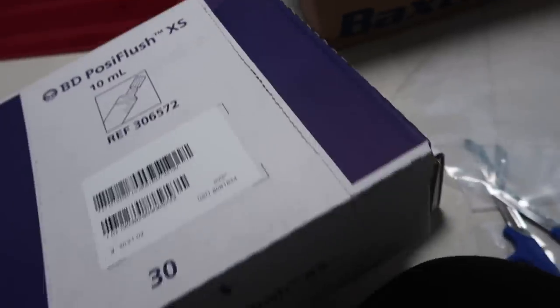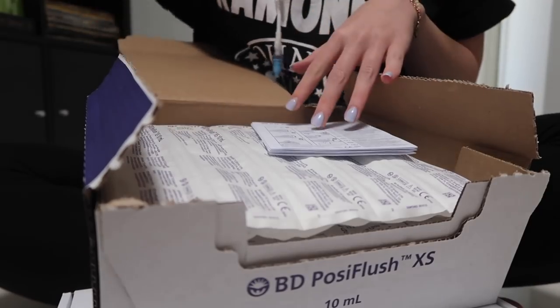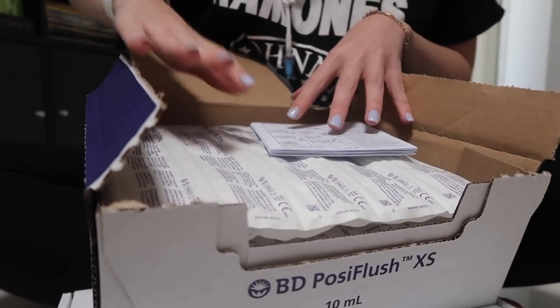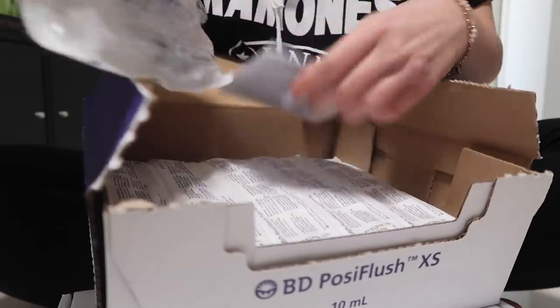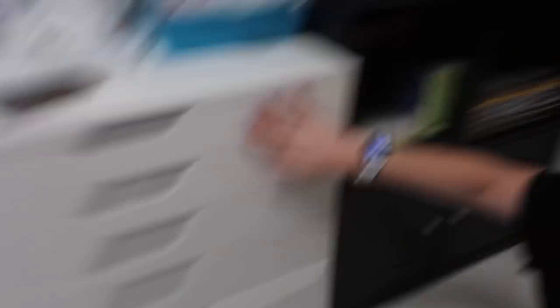Next we're going to do the posi flushes. I'm just going to open up this box. It hasn't been that long since we last restocked so it doesn't need too much in there, but I am going to put probably two rows. As you can see there's some stock already in there, but we're just going to add to it so now it's nice and full.